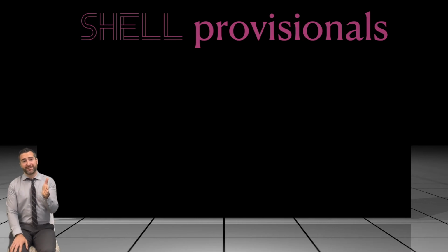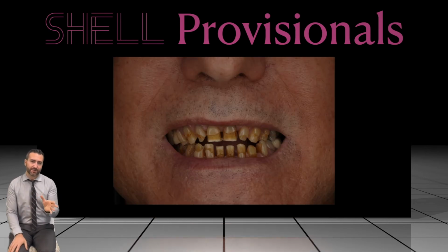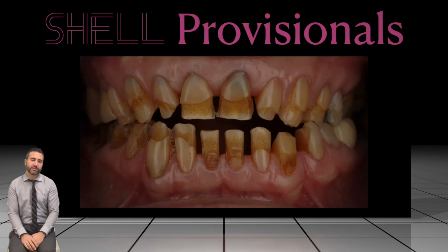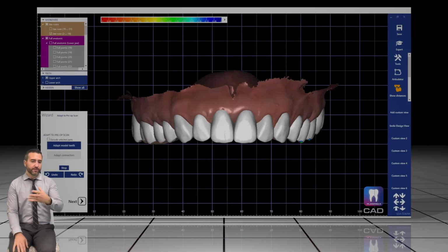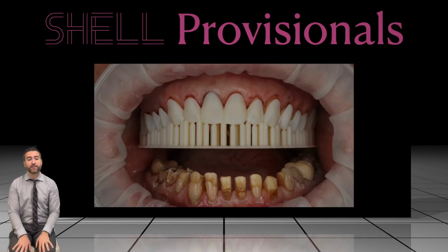Shell provisionals completely changed everything for us here. I hate injection temporaries with putties and bisacryls. We're able to have our temporaries 90% done before we actually touch a tooth. So here's a patient that came to us like this, has some issues going on. We did like we always do, a full upper and lower diagnostic wax-up, and made sure that we were able to work everything out digitally, including the occlusion. And here are some 3D printed shell provisionals.